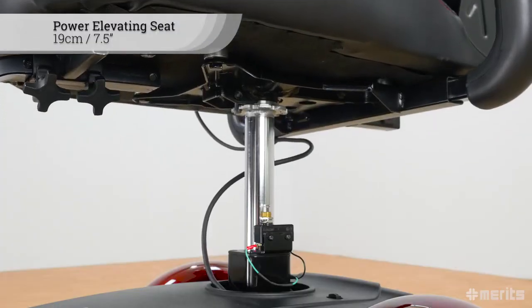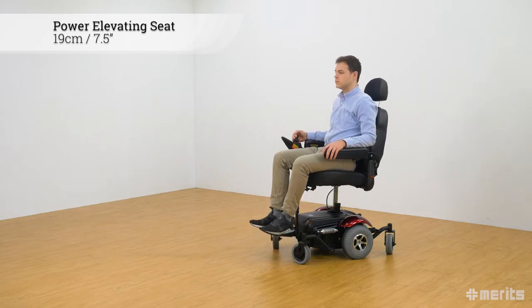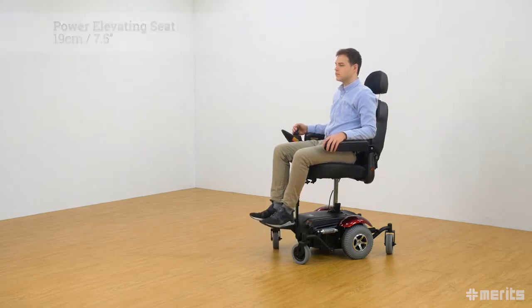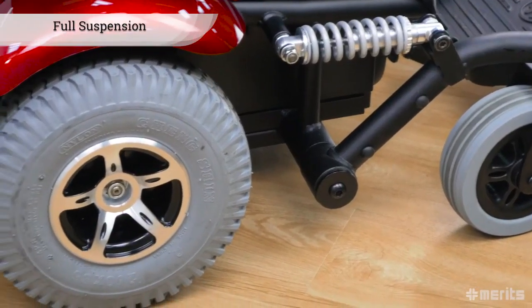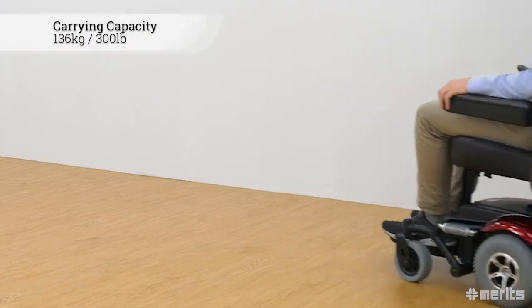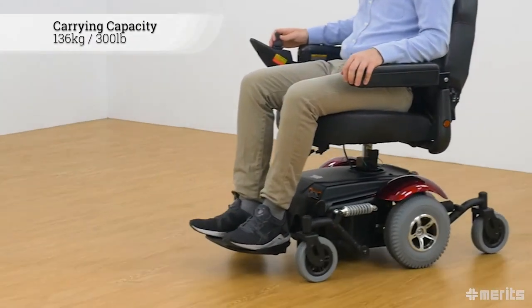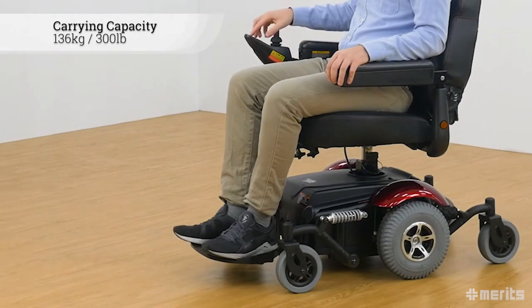also features a power elevating seat which can lift the user 19cm or 7.5 inches. The full suspension assures a smooth ride and adds to the already outstanding stability. Its carrying capacity of 136kg makes the Vision Sport a versatile workhorse.